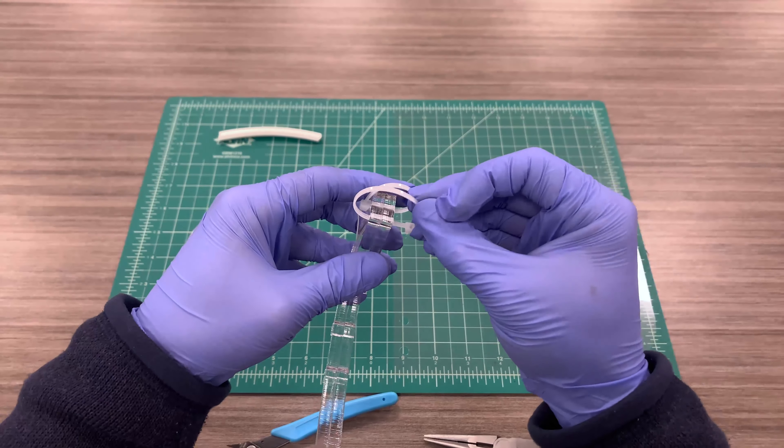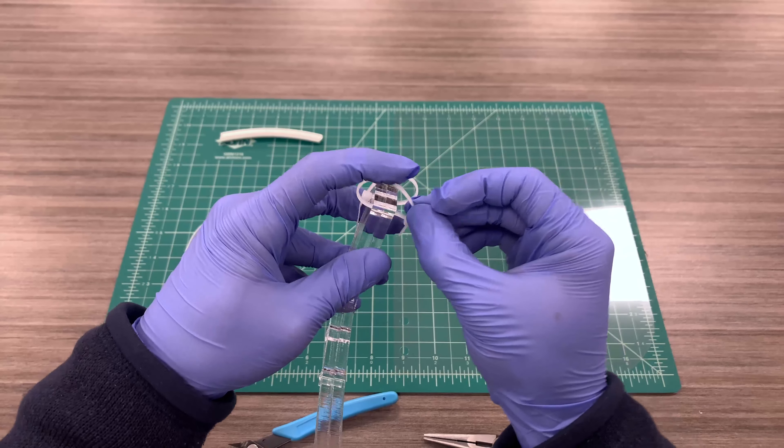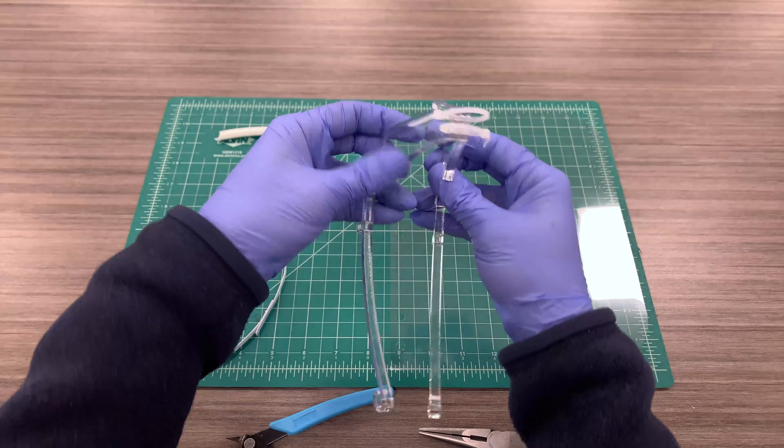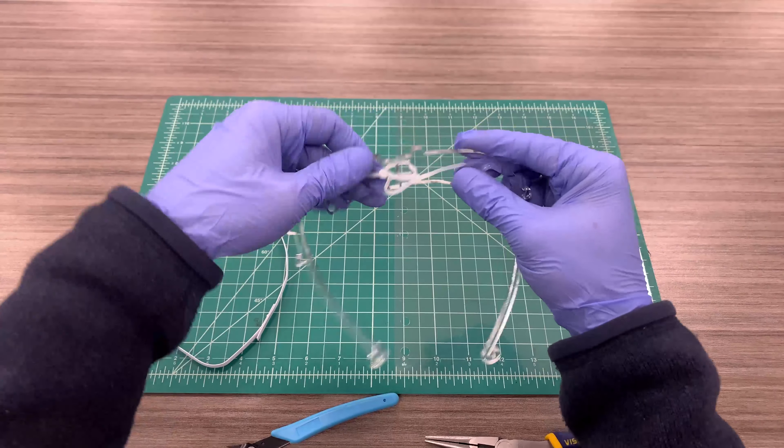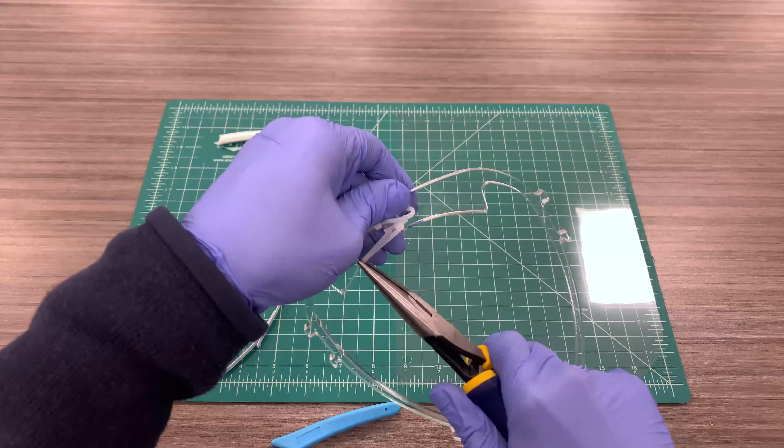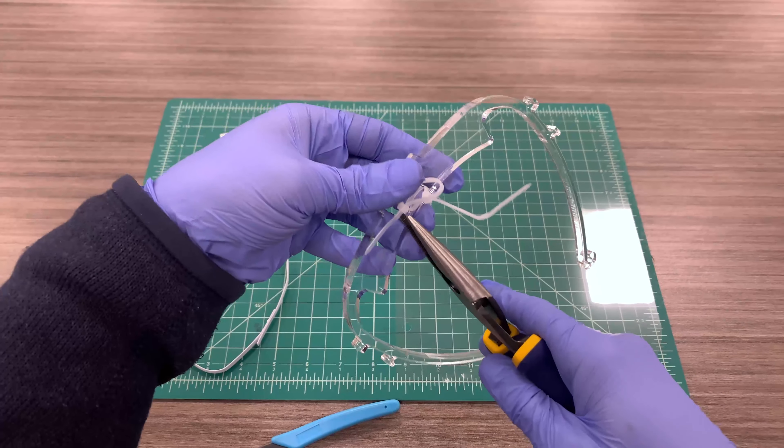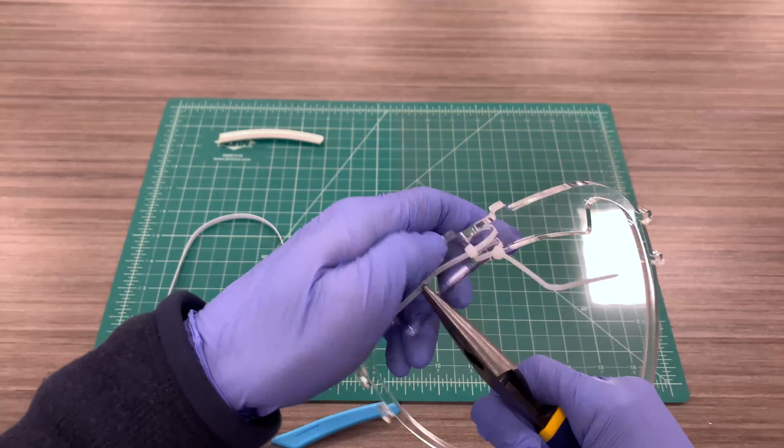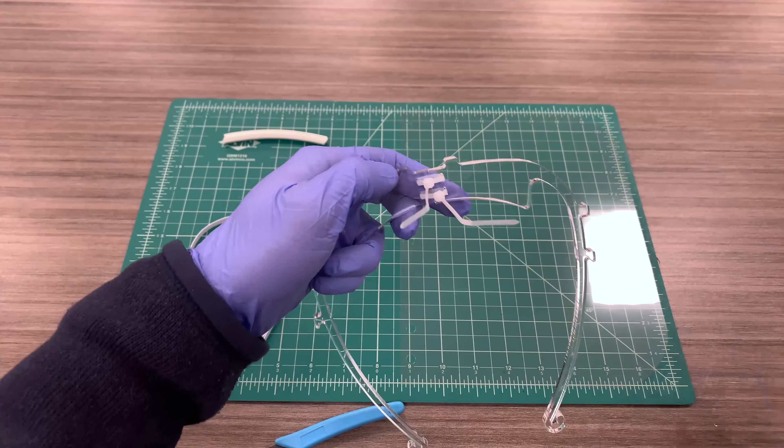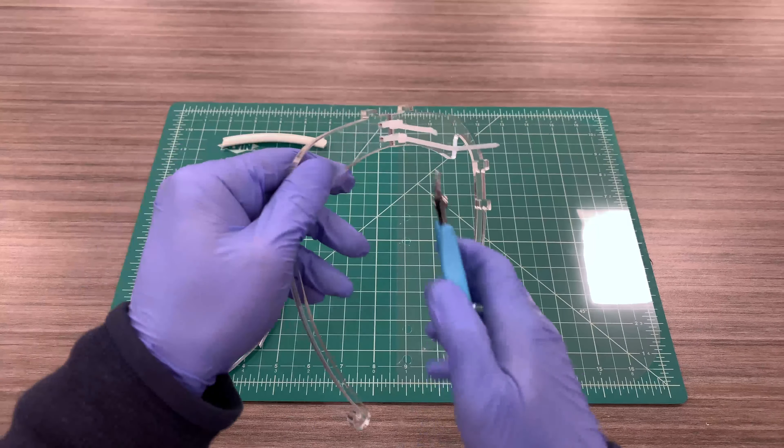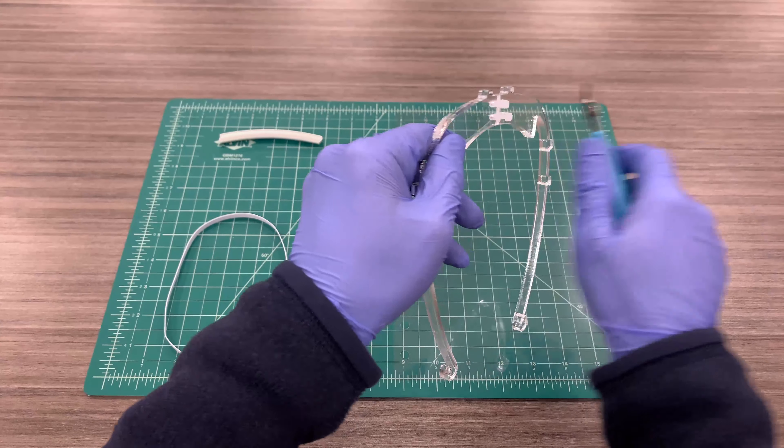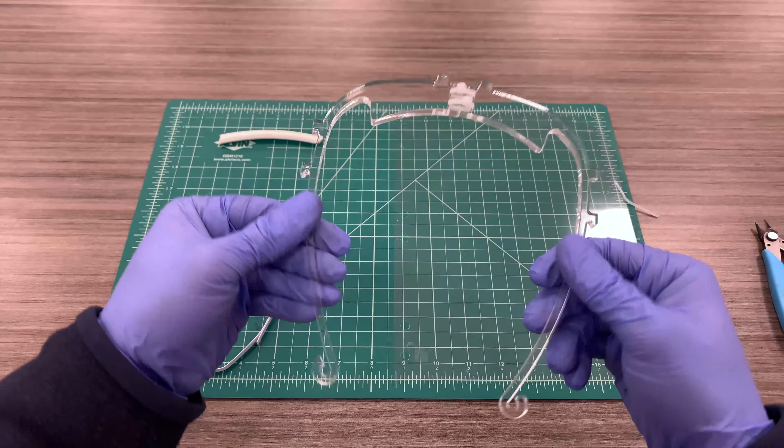Same thing. You're gonna open the visor, take your pliers, tighten it as tight as can be, and we'll take our wire cutters and cut the zip ties trailing ends as close to the head as possible. And that is the visor piece.